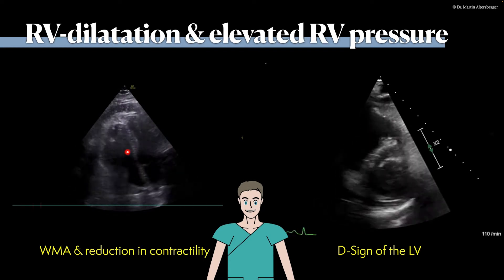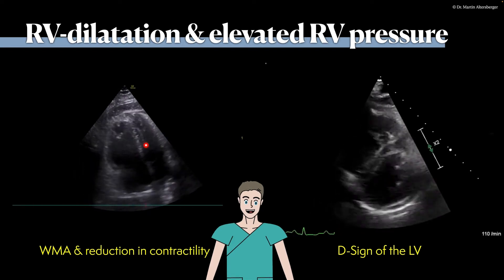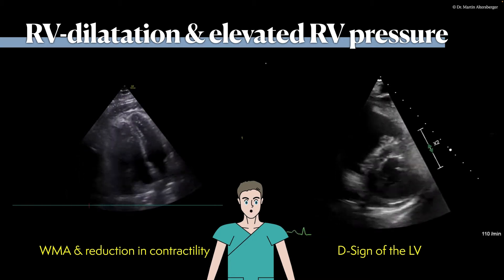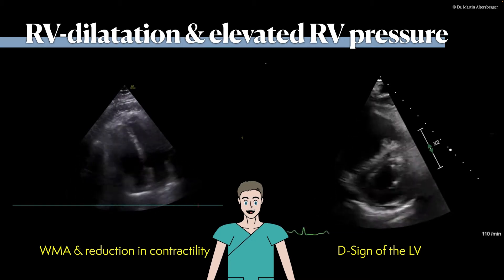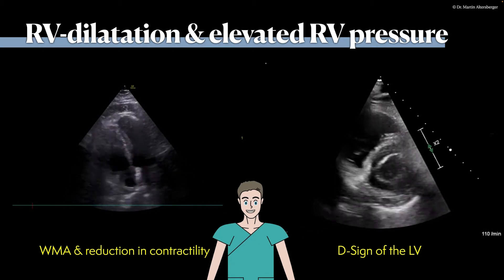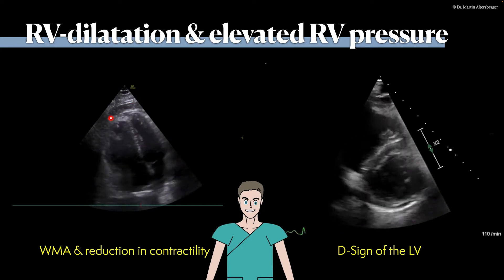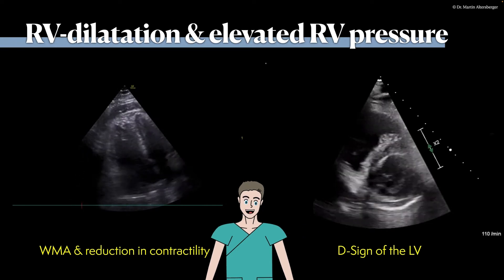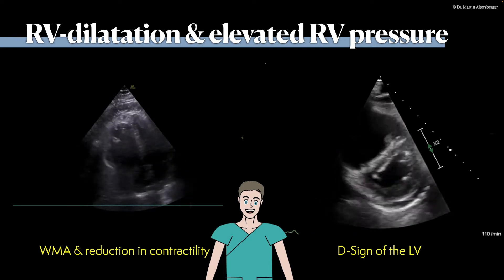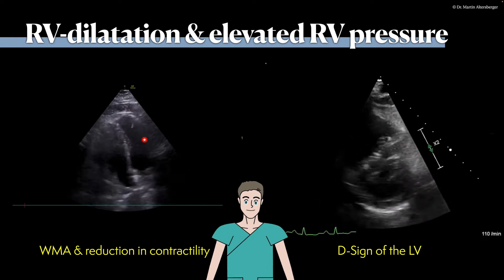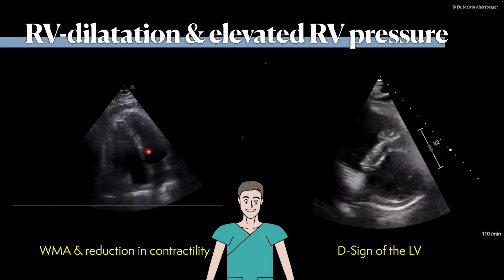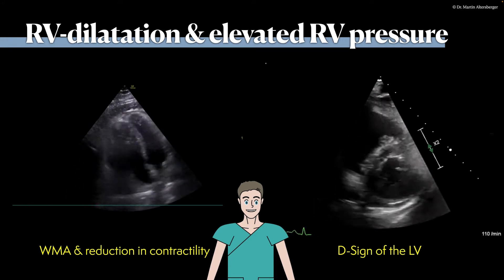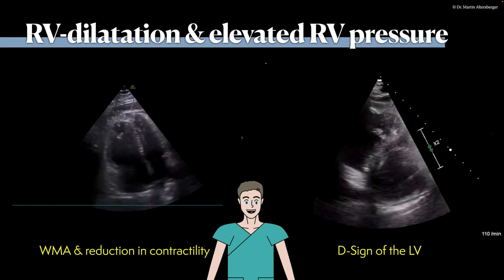Compare the right ventricle with the left ventricle — it's definitely not compressed, so it's a different situation compared to what we have seen before. We do see a degree of epicardial fat but definitely not a relevant pericardial effusion. The left ventricle is very small in size due to the severely dilated right ventricle.